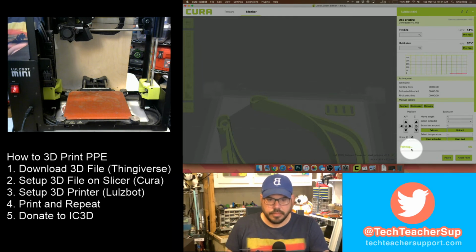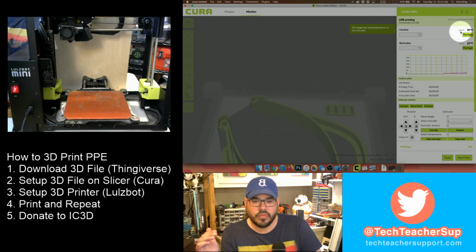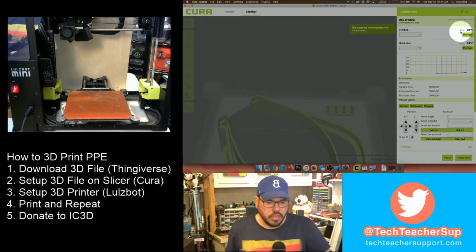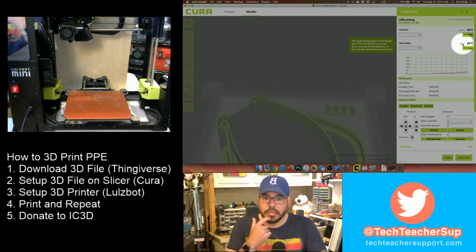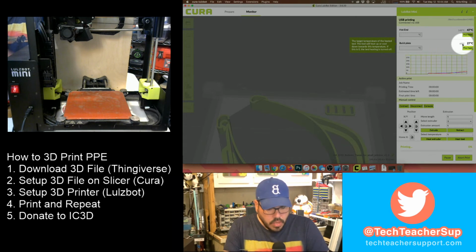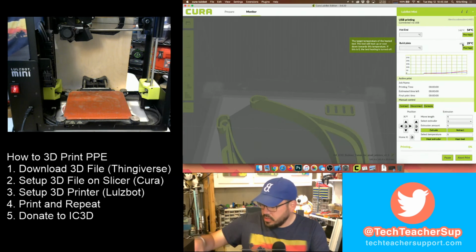All right, perfect. And now we're going to go through this sort of heating up process. Eventually this is going to get to over 400 degrees Fahrenheit. Right now it's at room temperature. So it needs to build its way up there to get to the heat. And of course the plate that it prints on is heated as well to help that sort of adhesion. So we are essentially done. This is going to do its job for the next 2 hours and print out one of these for us.